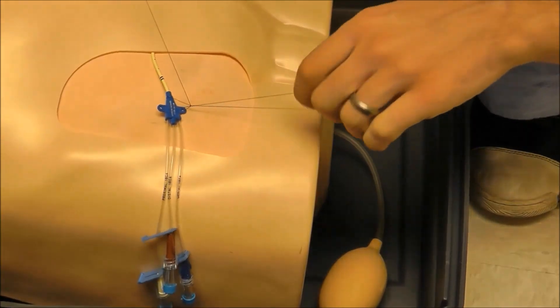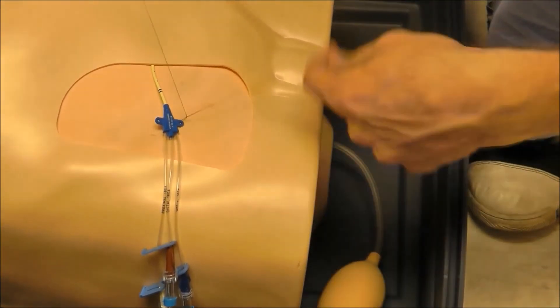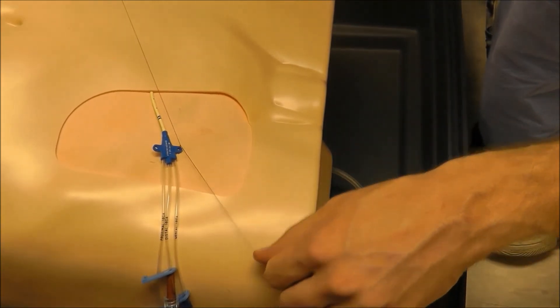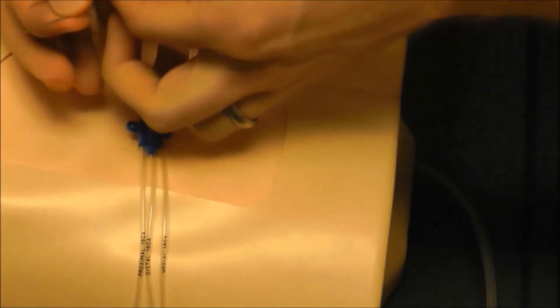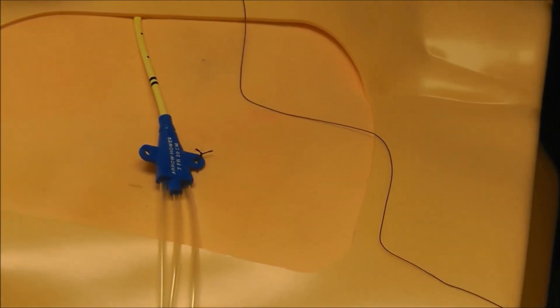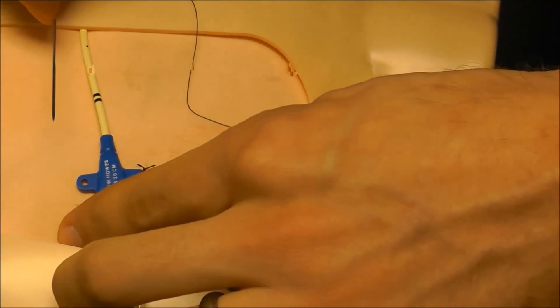Go ahead and do one more, then finish off with one of those knots. I left enough length on the needle side to have enough suture to do one on this side as well.